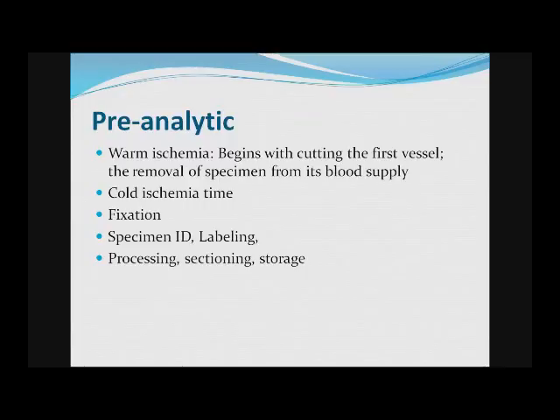If you're doing in situ hybridization, you're most likely looking at RNA, be it messenger RNA or other RNAs, or you're looking at DNA. So we have to always keep these pre-analytic conditions in mind in whatever we do, and when we're troubleshooting what we are already doing.